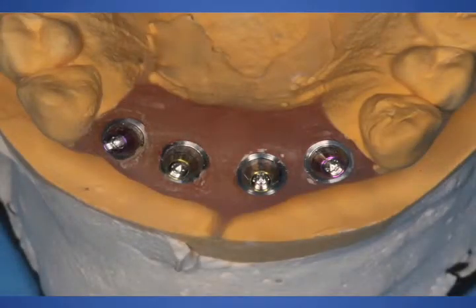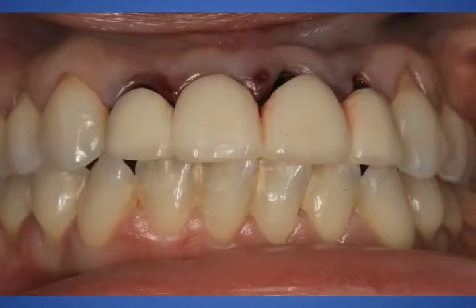Going back, the dental laboratory had given us this same positioning of the implants on a model prior to me ever touching the patient. Immediate seating of the transitional crowns. Again, they are splinted for security.